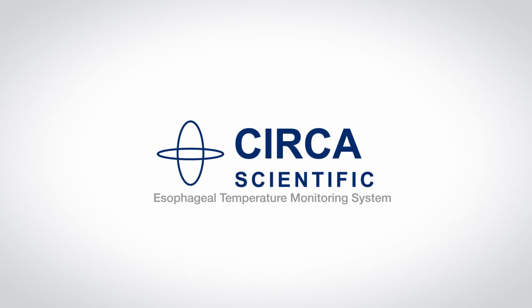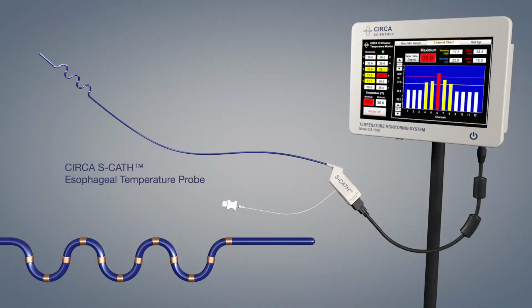CIRCA video training. The CIRCA esophageal temperature monitoring system consists of three primary components: the CIRCA S-CATH esophageal temperature probe, the CIRCA temperature monitor, and the CIRCA S-CATH interconnect cable.